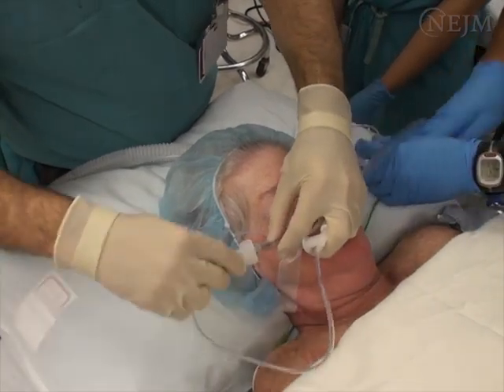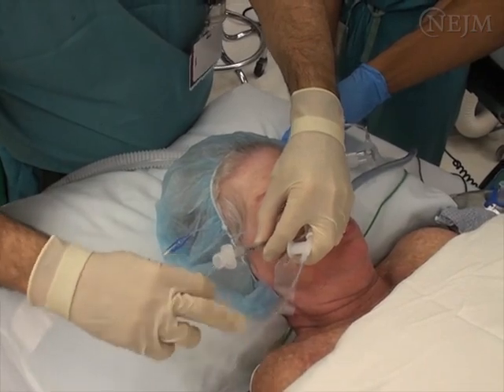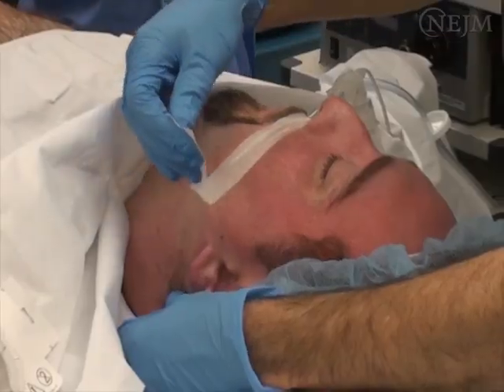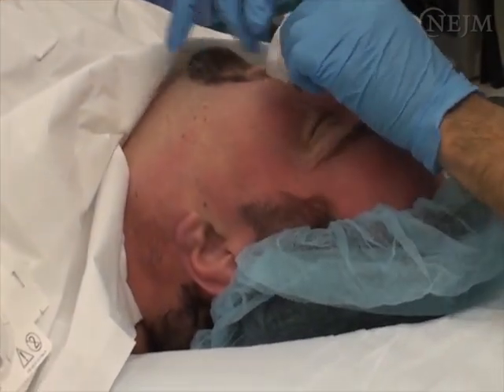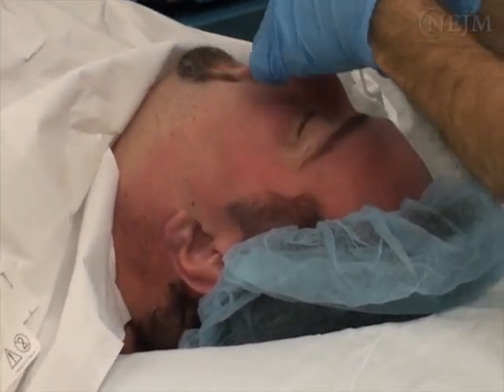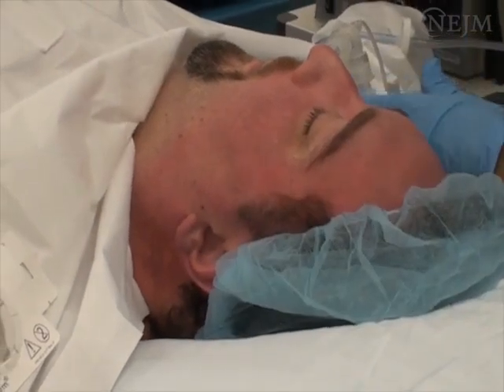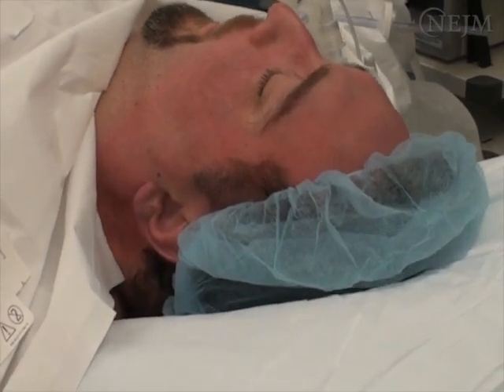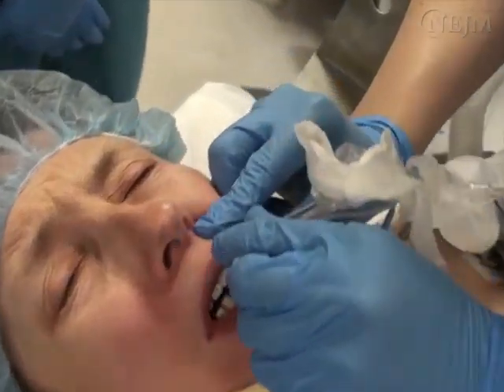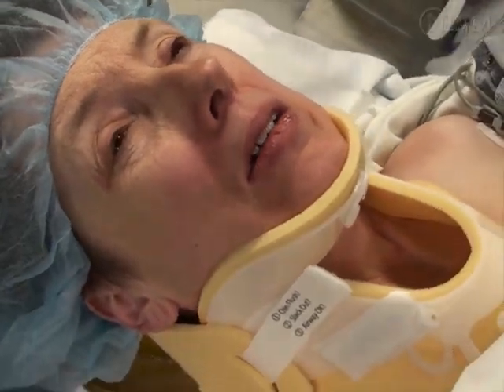Suction the patient's endotracheal tube using a disposable catheter or an inline suction device, and then carefully remove any tape or securing device in preparation for extubation. Avoid inducing abrupt head and neck movements, which may cause the endotracheal tube to stimulate the trachea and trigger coughing. A patient with an injury to the cervical spine may require additional neck support.